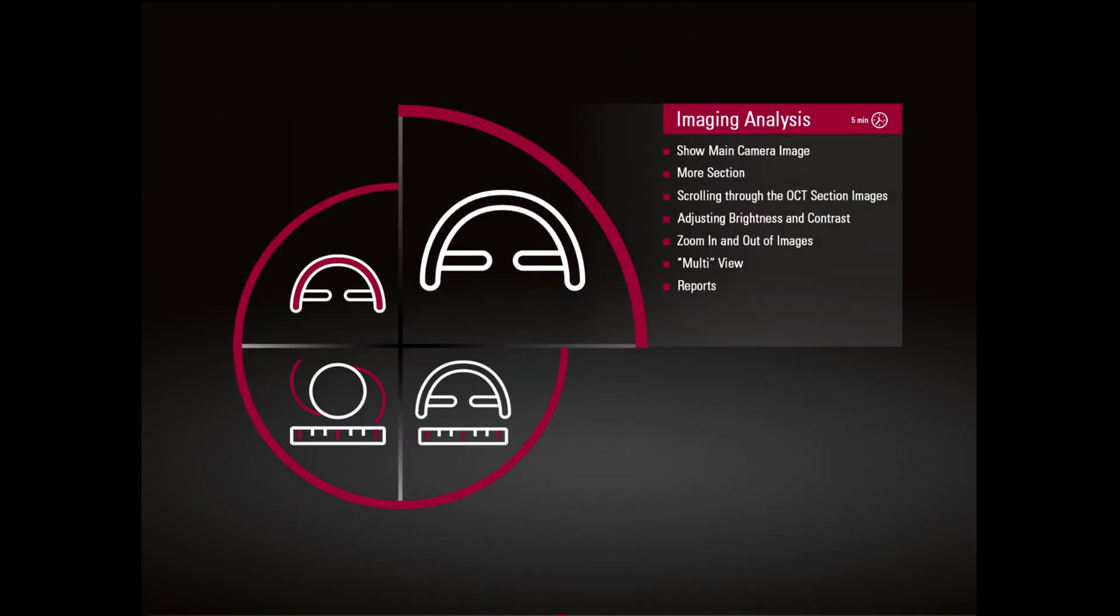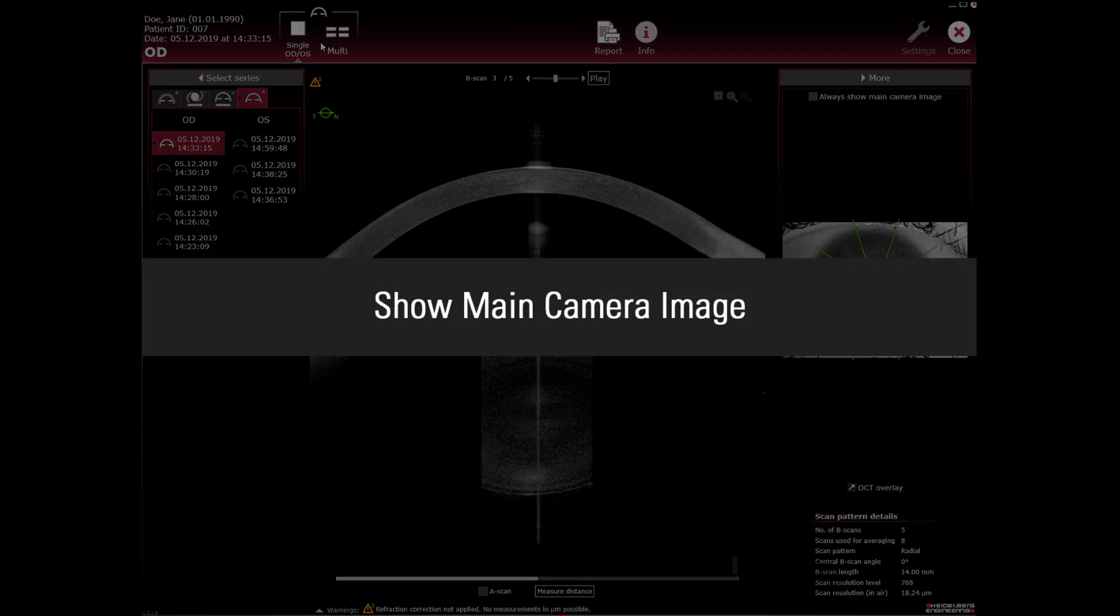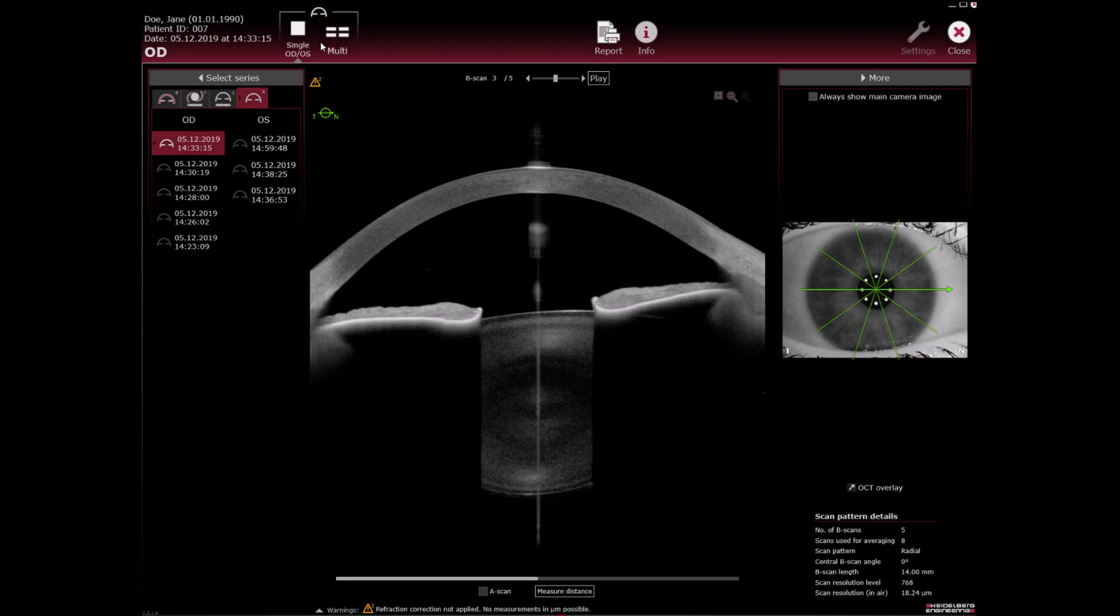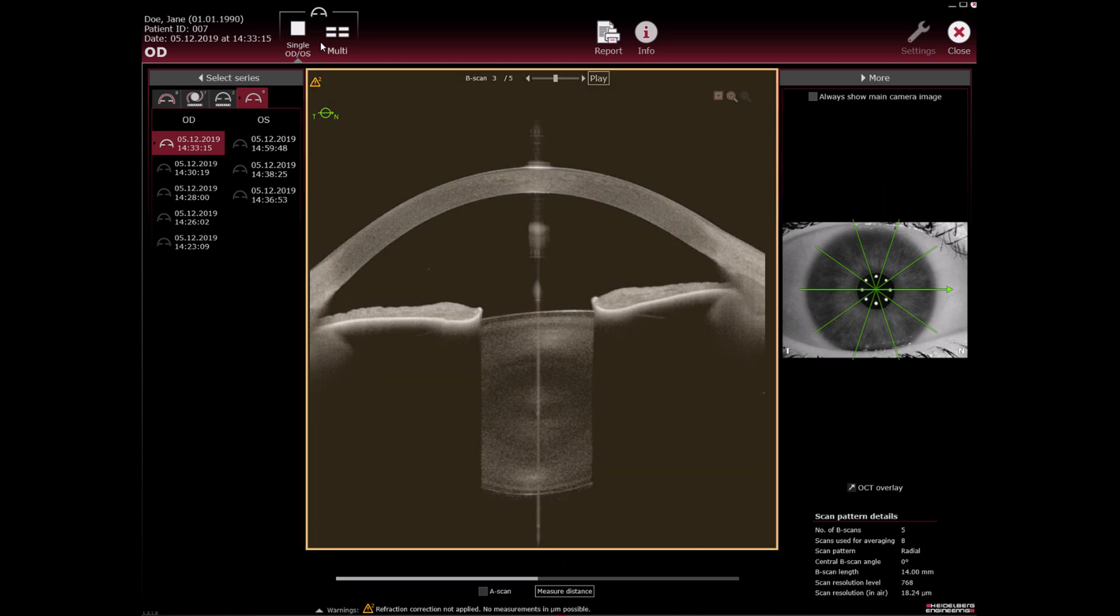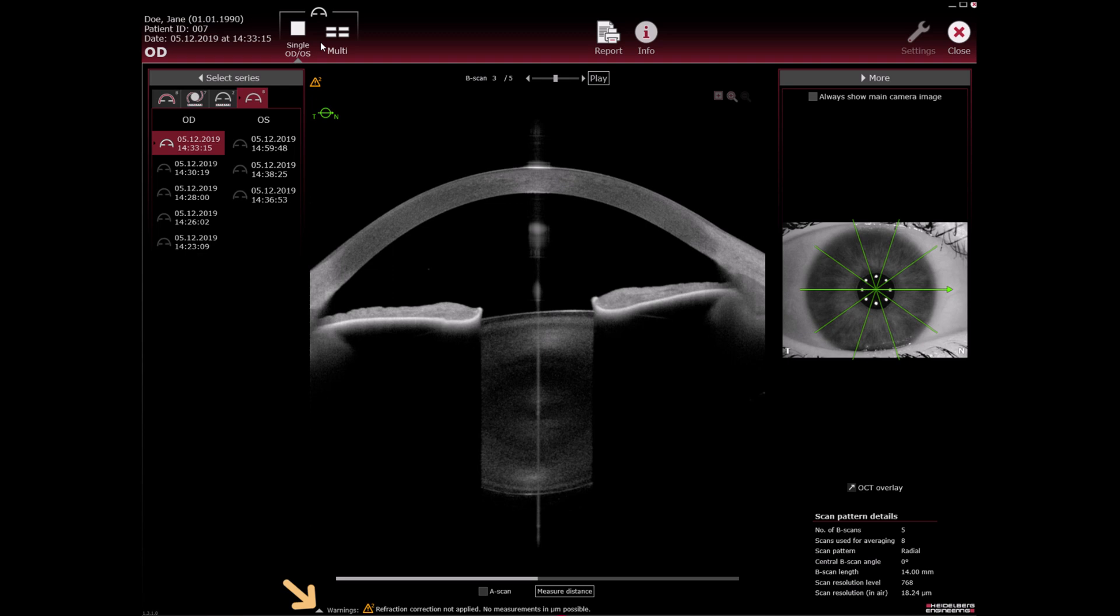Imaging analysis: Show main camera image. In the imaging app, you can review the OCT section images and the camera images. Refraction correction and parameter measurements are not applicable to images acquired in the imaging app.